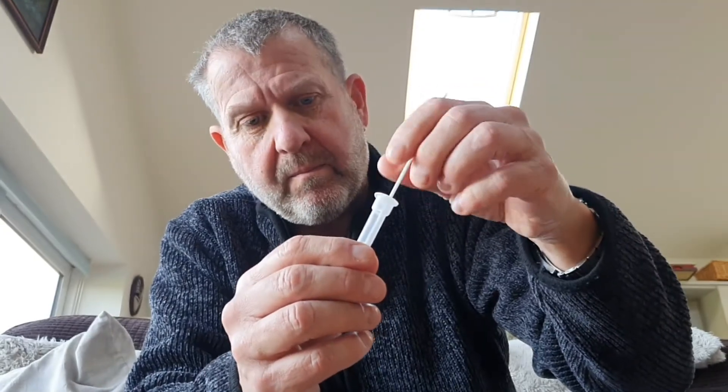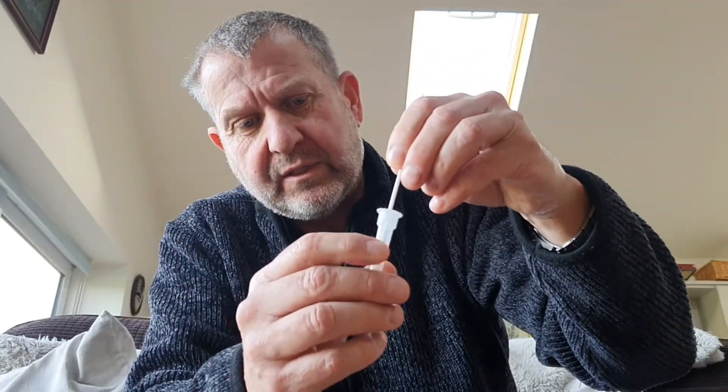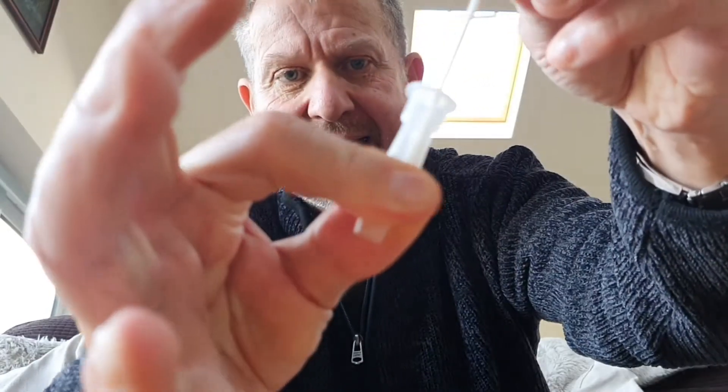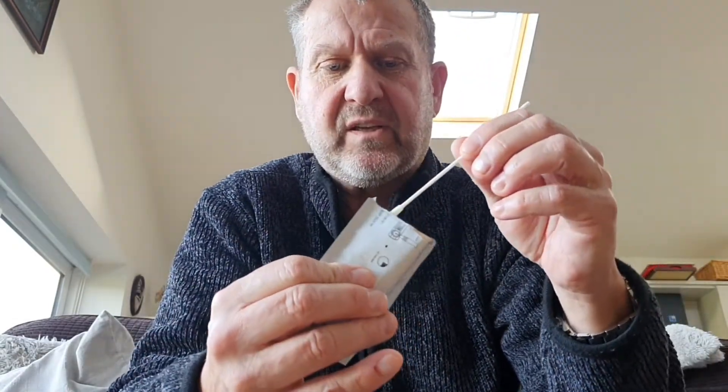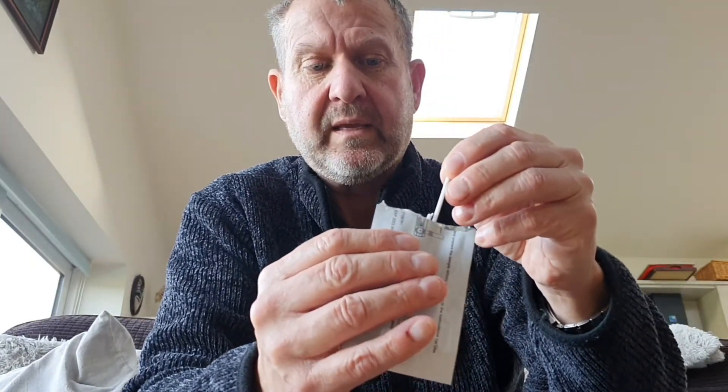Then you stick it in here and dab it up and down a few times, turn it round and round, and then you leave it for one minute. One minute goes by pretty quickly. Now, before you take it out, because the little head has absorbed quite a lot of the liquid, you can use the tube to squeeze and twist the liquid out. So this thing will then come out relatively dry. Stick it in the original plastic container — be careful not to touch the top. Then fold that across and break it into the container, and the whole lot goes into the little plastic bag, nice and safe to be disposed of.